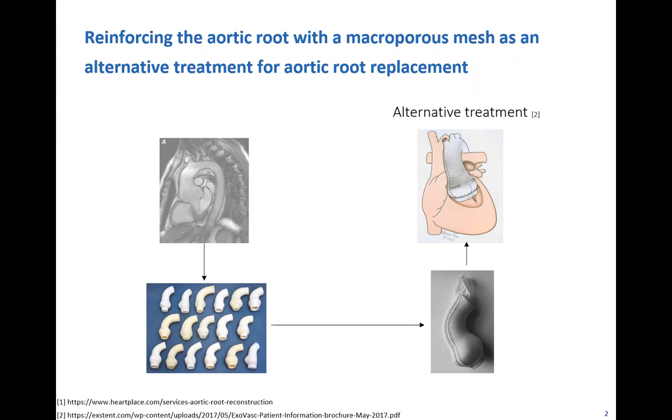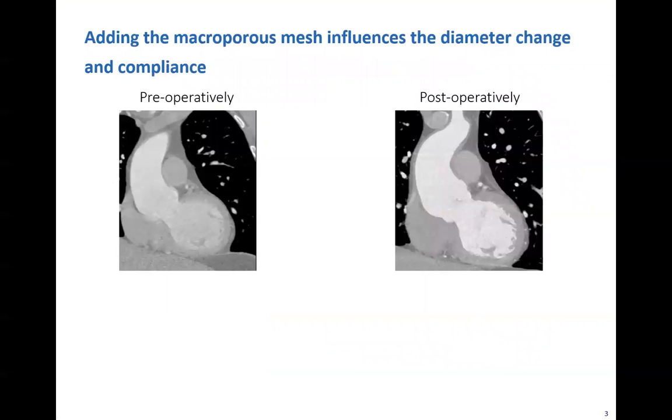Controversy around this method exists, so we investigated how the addition of this macroporous mesh influences the motion of the aortic root. Within our center, a 44-year-old Marfan patient underwent this surgery.